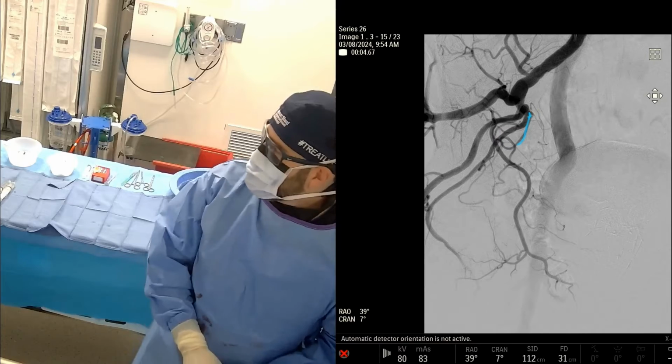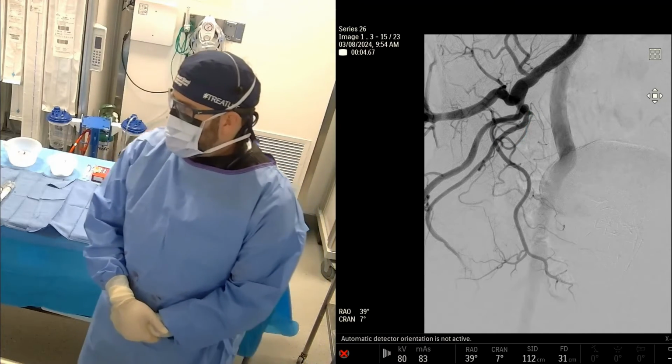What was the other side? Was it pudendal or gluteal? I think it was off the gluteal. It was a 5. It was gluteal. I have to go back and look.